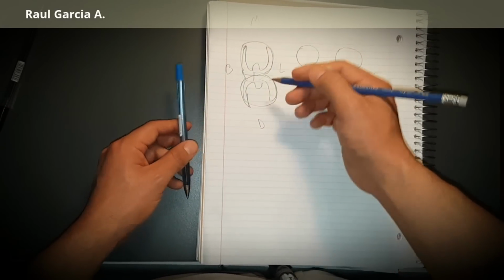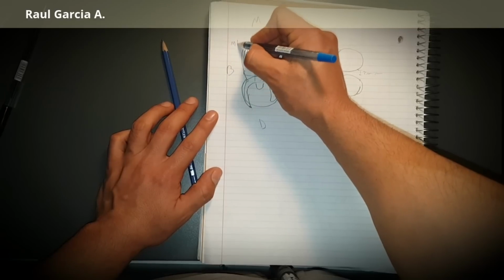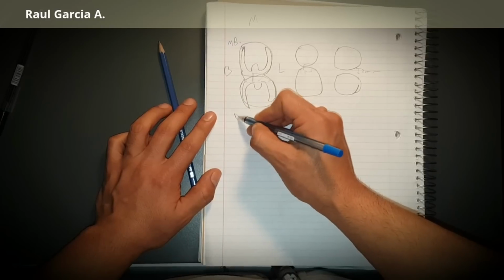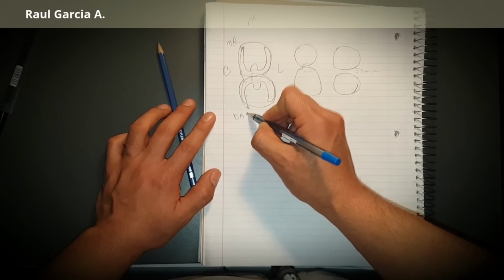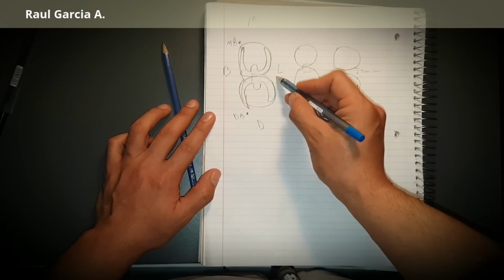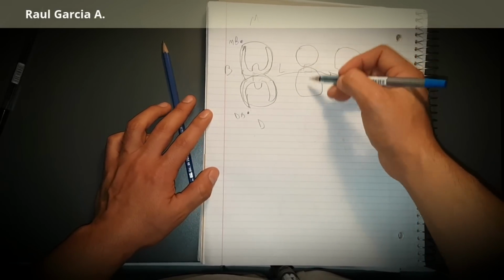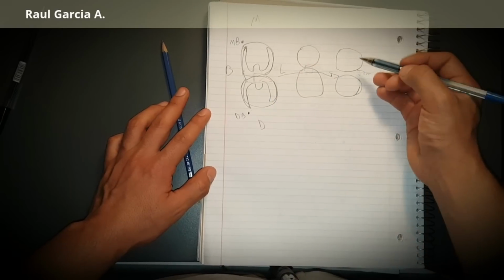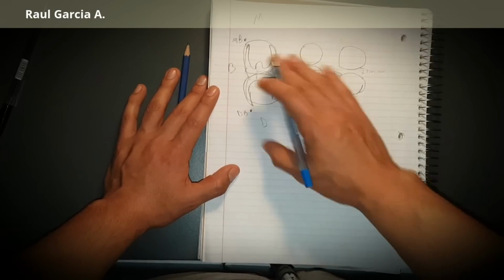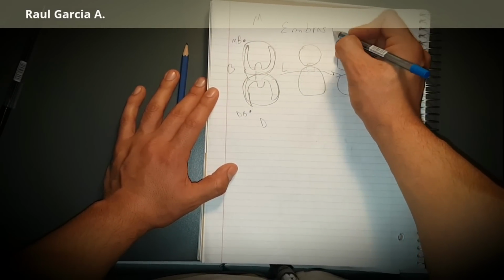Okay, so you see you're engaging the mesiobuccal undercut in this molar and the distal buccal undercut in this molar. And we're filling the space here. And if it's a premolar, we can also use it between premolar and molar, usually when we have this space. Okay, so this is the embrasure clasp.